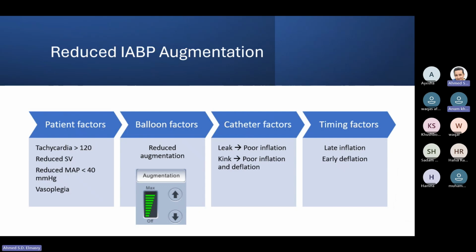Some hospitals, yeah, I have seen some hospitals doing both together, decreasing both together. And I have seen reducing by augmentation first, and then later on they go for ratio reduction. Some hospitals have a protocol doing this.